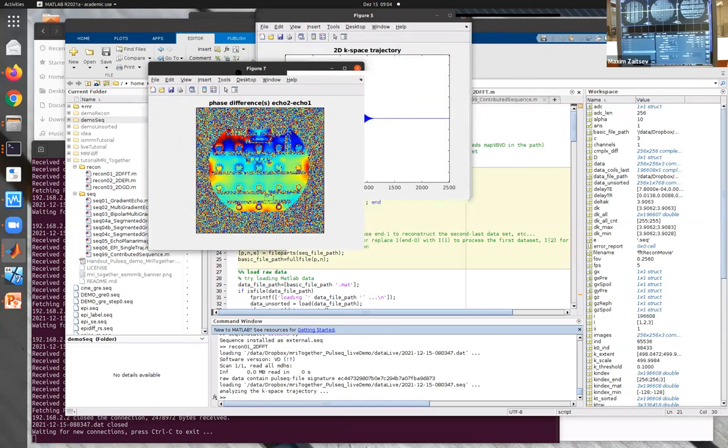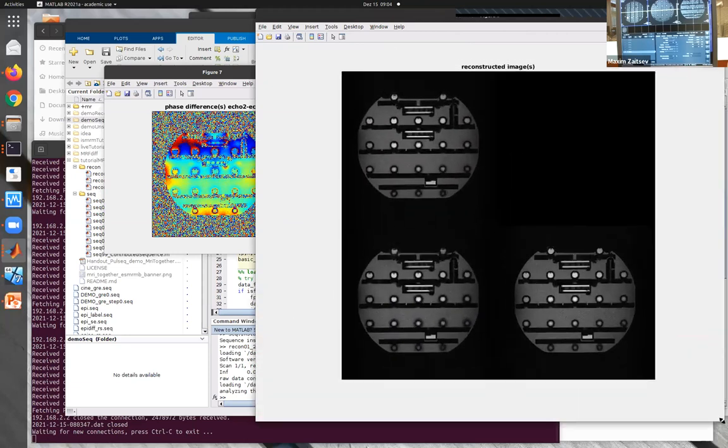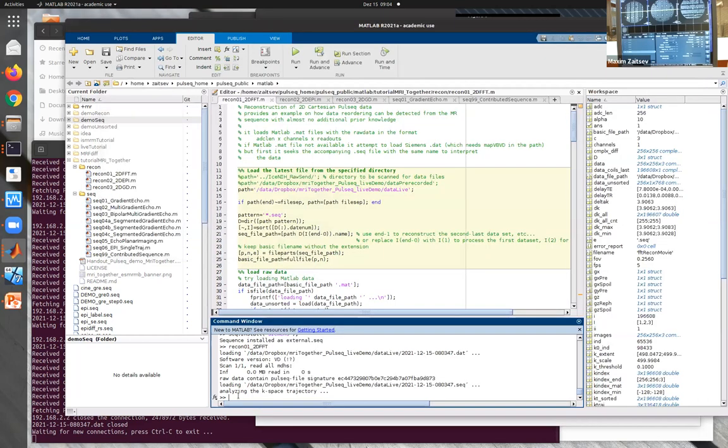And now because it has multiple TEs, the recon script shows you images from single TEs, and also the phase difference between the first and the second echo, if you would like to use it for phase field mapping or whatever. Okay.